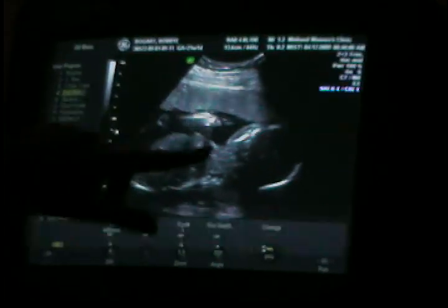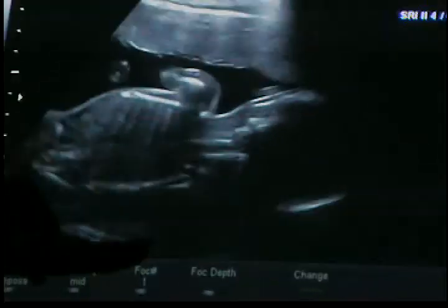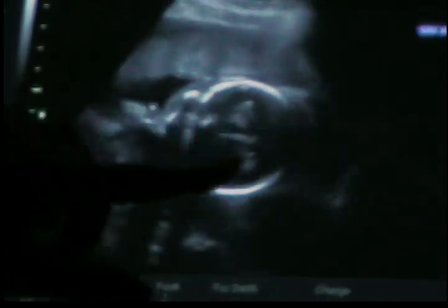I haven't felt any movement, so please tell me everything's good. Yeah. Nice heartbeat. Get our recording started. This is our abdomen here. That's the diaphragm, that black line separating the heart from the stomach. Kind of see our little ribs coming in back here. This little arm that's moving. This is our spine. See an ear. Let's see, our head's down low, which is good. That's where we want it eventually anyway. Top of the head here.